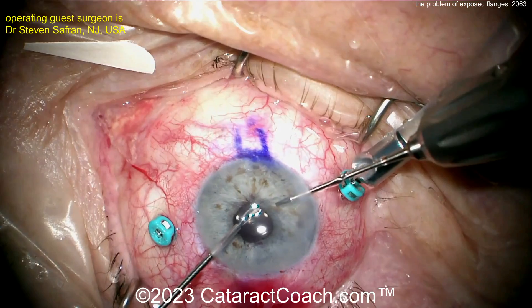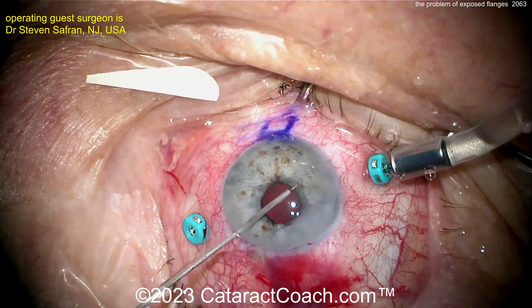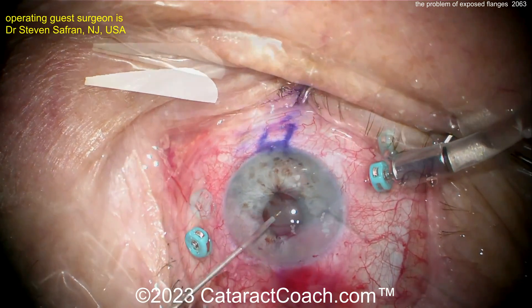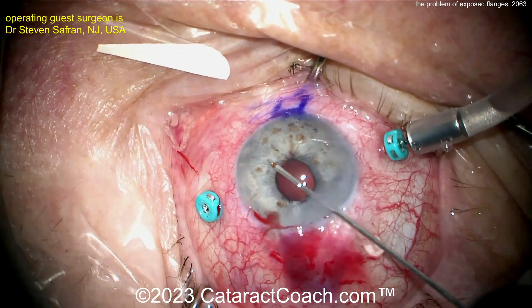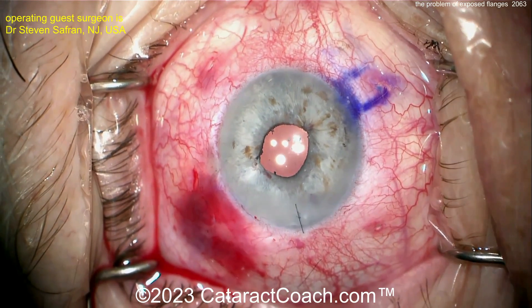Here's that suture going in, now he's tying it within the eye, cinching it down, and cutting it. Now he's going to use diathermy to do a little bit of contouring of the iris at the pupil just to make it more symmetric and round. And there's the end of the case — a beautiful result.